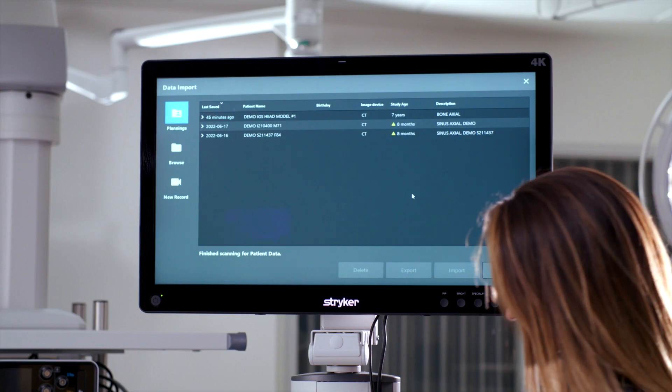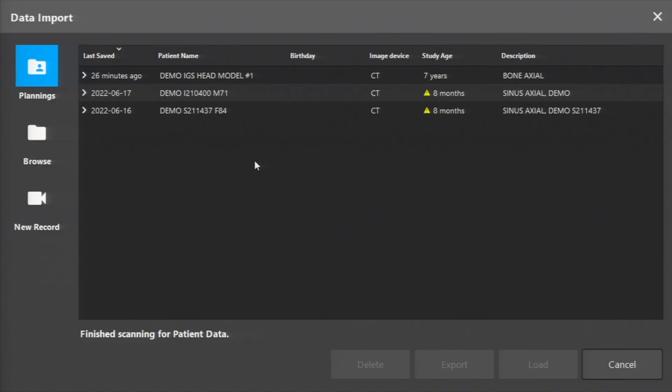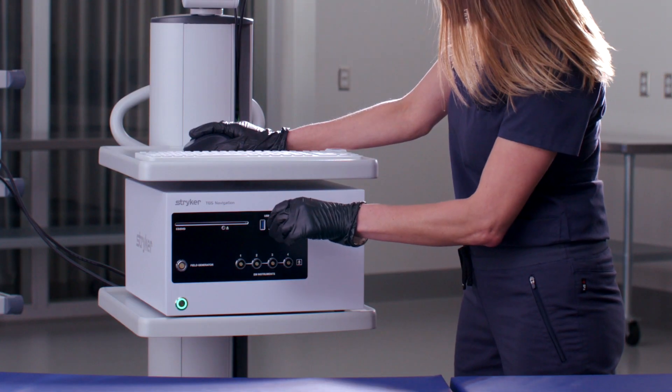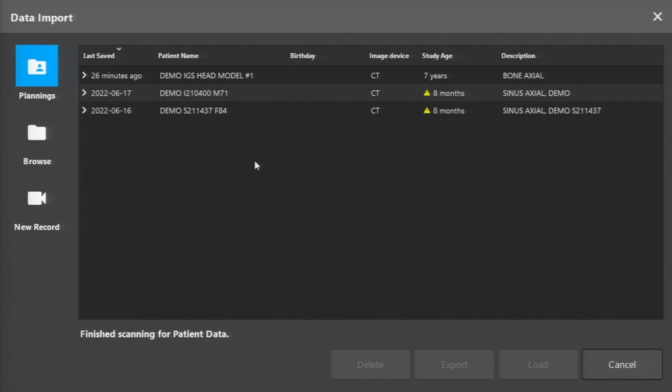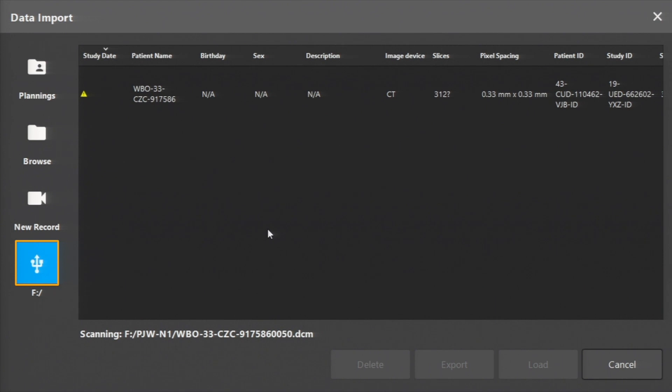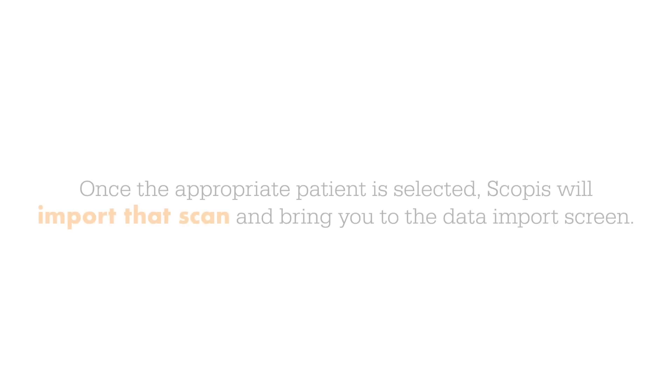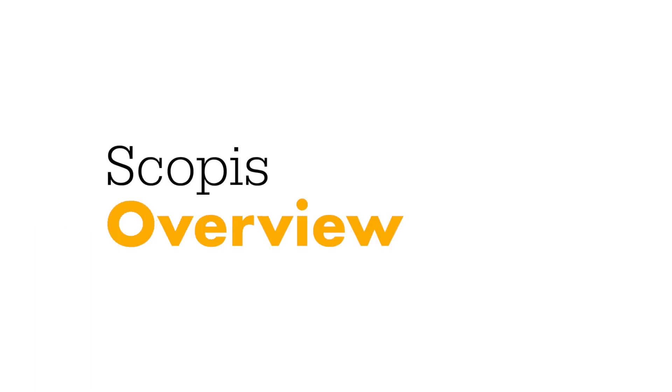From the data import screen, you can choose the scan you'd like to upload by clicking the respective icon on the bottom left-hand side of the screen. For example, when plugging in a USB to upload a scan, a USB icon would appear. When clicking the USB icon, the software starts to scan the USB drive for images and shows a list of image series available for upload. Once the appropriate patient is selected, Scopis will import that scan and bring you to the data import screen.